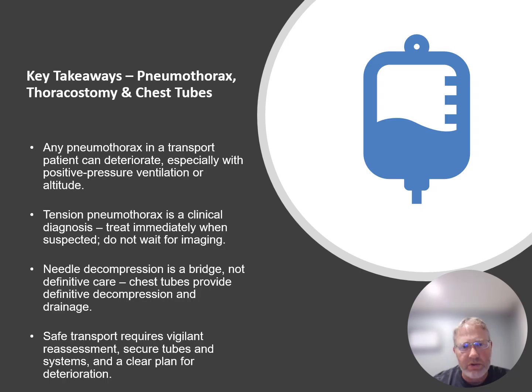Tension pneumothorax is fundamentally a clinical diagnosis. If you strongly suspect it in an unstable patient, please treat it immediately and do not wait for imaging. Needle decompression is a bridge, not definitive care. Whenever possible, you want a chest tube in place for ongoing decompression and drainage while en route.